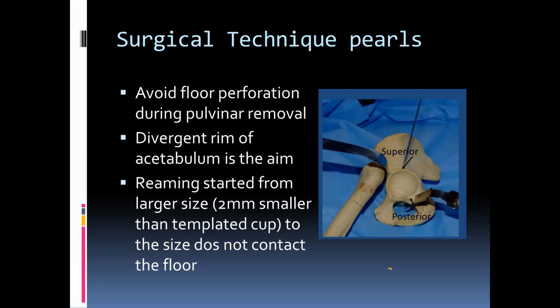After that, you decrease the reaming to 48. You can see that in this sequential decrease of the reamers, you can take up the periphery of the acetabular shell in order not to continue the reaming of the medial side of the acetabulum. After that, when you have reached the 48, for example, and the tip of your reamer is not attached to the medial wall, this is when you stop.